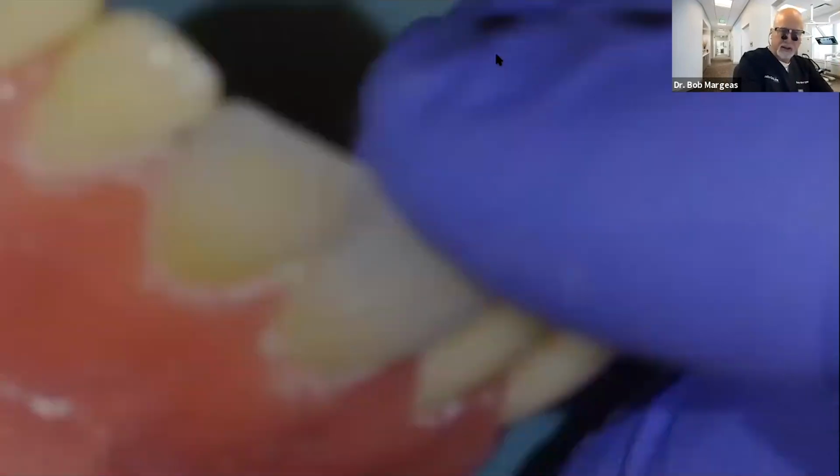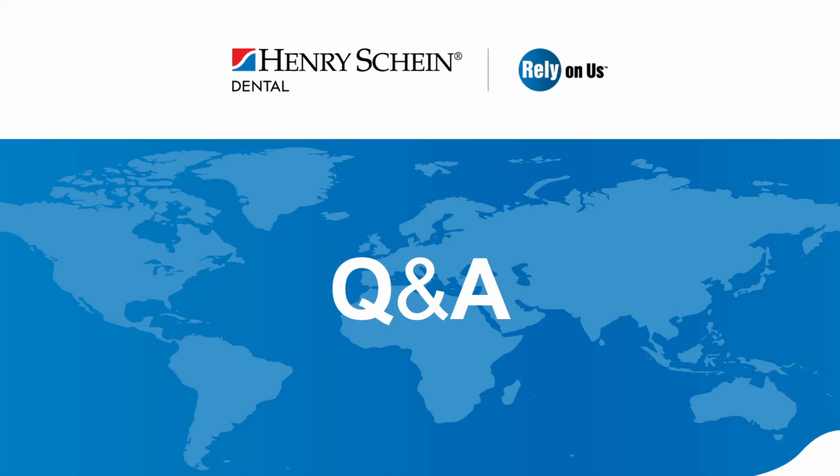So if there's any questions that you may have, I'm happy to try to answer some of those questions. Great, thank you. We've got lots of questions. I'll kind of start from the beginning, so apologies if we backtrack slightly. The first question that came in was, what matrix bands do you use to create your interproximal contours?